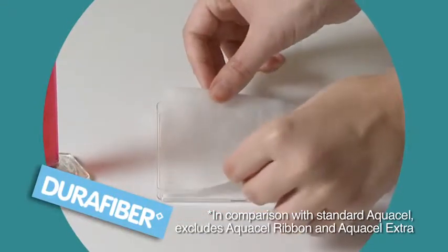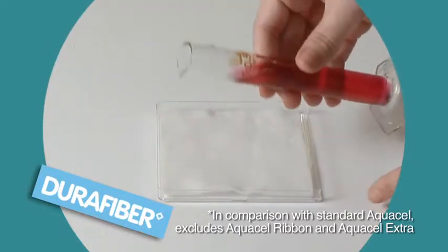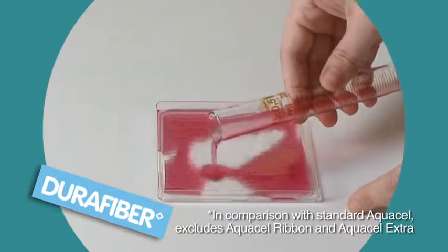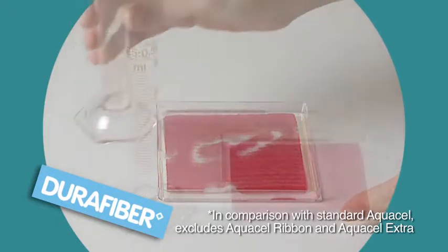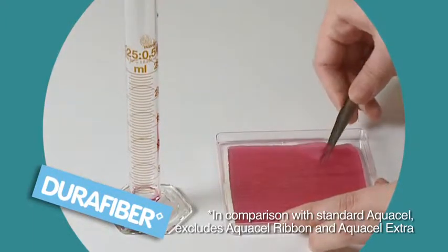So as you can see DuraFibre offers greater absorption and less shrinkage than standard Aquacel in this test. A high absorbent capacity and minimal dressing shrinkage will help provide effective fluid management, sustained wound bed coverage and optimal dressing efficiencies.